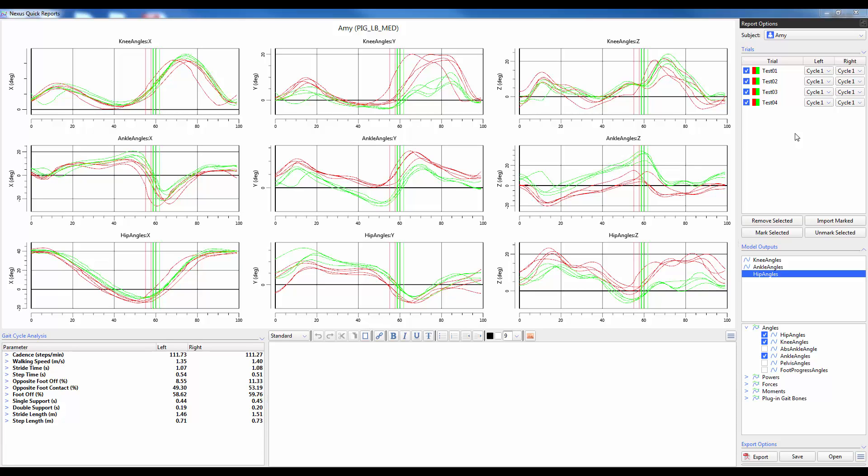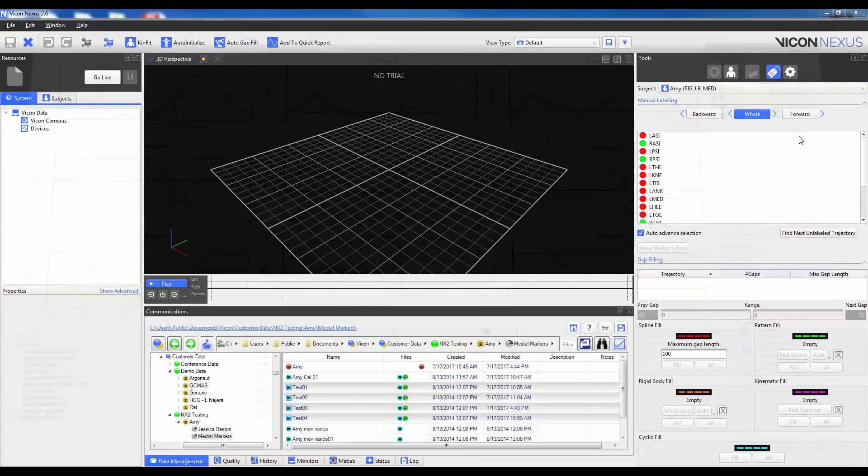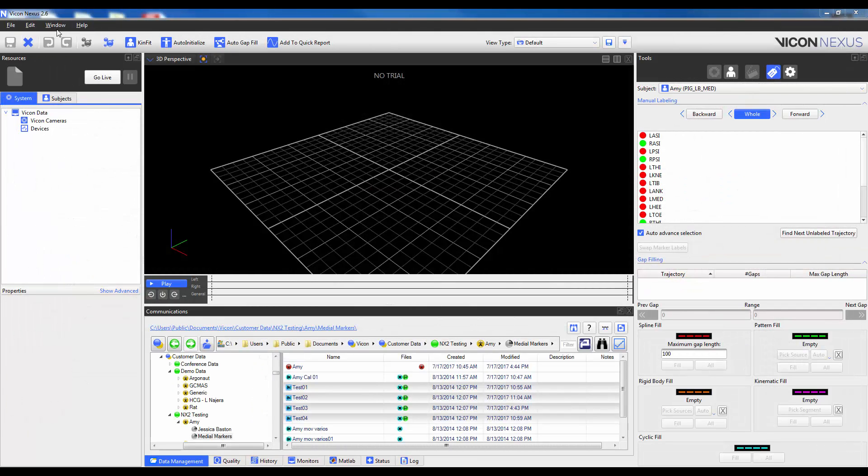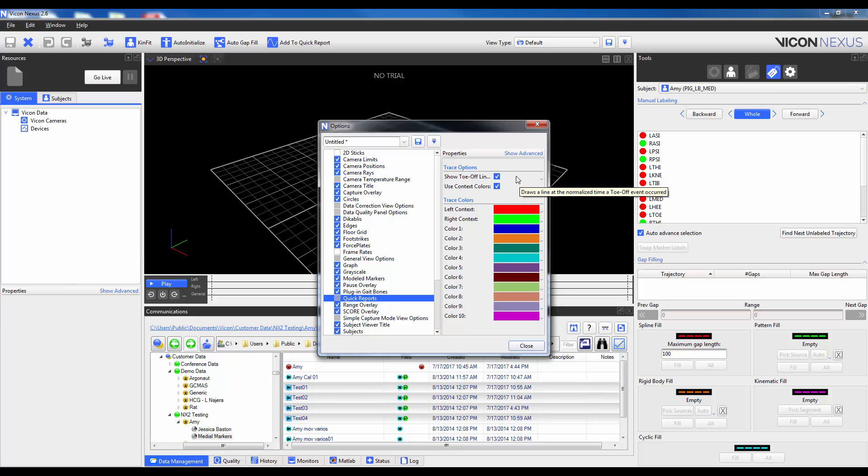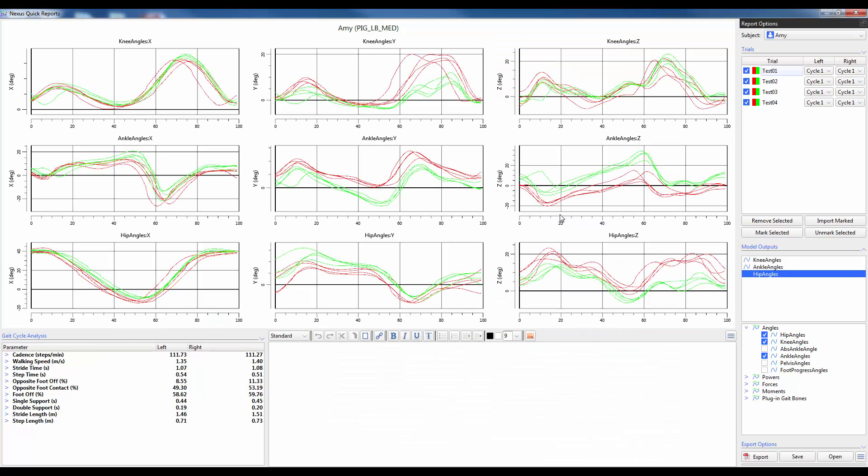Finally, it is also possible to change the appearance of the graphs that appear from the model outputs. By default we will have the classic color scheme of red and green for the left and right sides respectively. We can also see that the toe up lines for each of the gait cycles appears in the graph. To change this, I'm just going to go ahead and close quick reports. I'm going to go into window, options, make sure that quick reports is highlighted and we can see that we have two options. We can either toggle the toe offs on and off. So I'm going to uncheck it first. Open quick reports back up and we can see that the toe off lines have now disappeared.